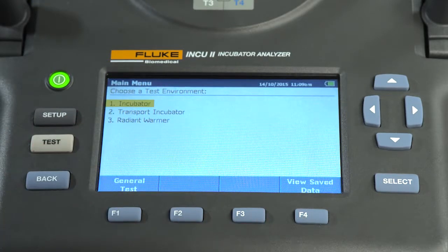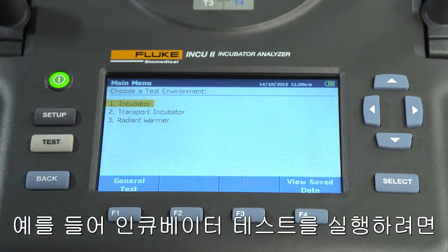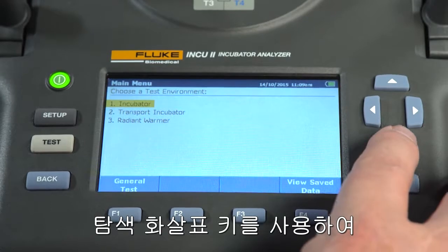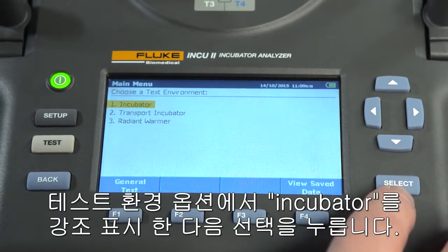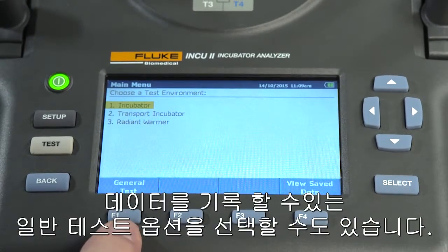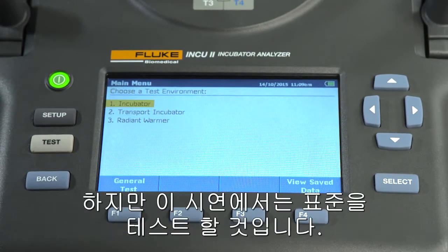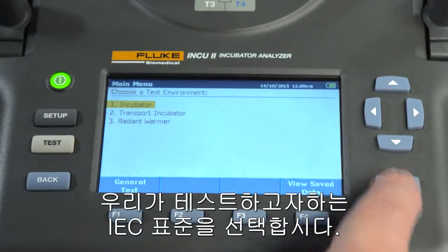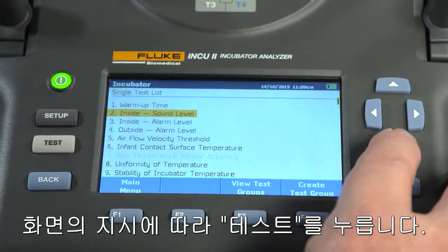Select a test environment, choose a general test, or view saved tests. For example, if you're going to run an incubator test, highlight incubator from the test environment option using the navigational arrow keys, and then press select. You can also choose the general testing option, which allows the user to log data without testing to a specific standard. But in this example, we're going to test to a standard. Let's choose the IEC standard we want to test against. Follow the on-screen directions, then press test.